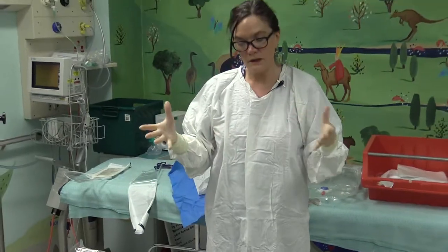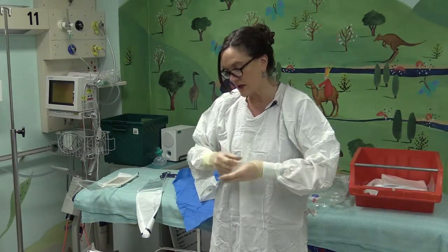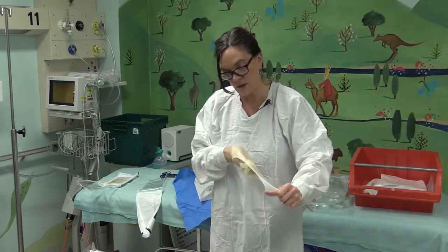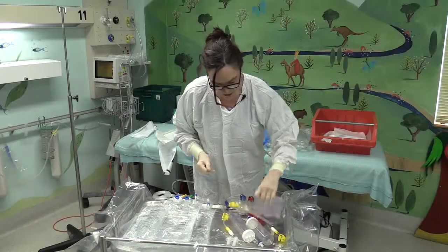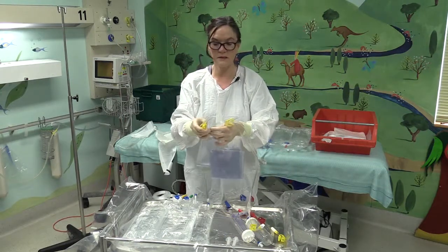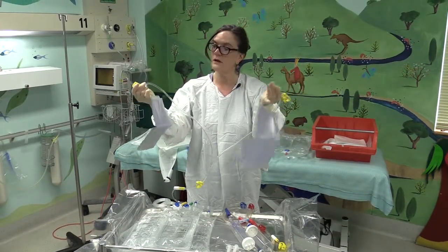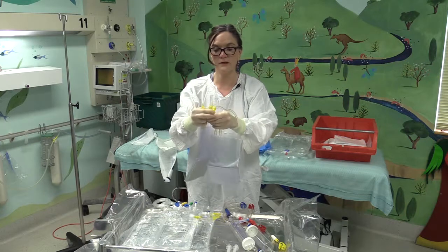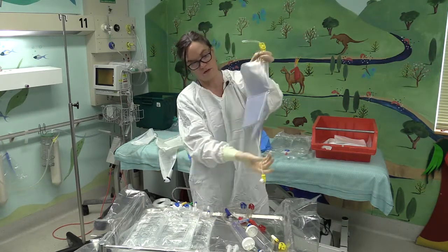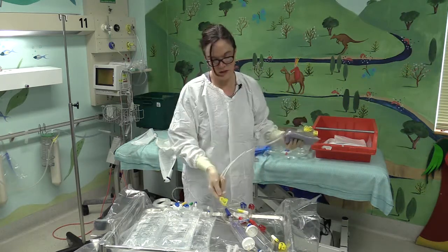I'm now going to prepare my set, and I am going to change my gloves, just in case I've touched anything or contaminated them. Okay, I'm just going to organise my set. So I have a drain bag which has got 2 large drain bags on. So clamping it off, clamp each end off so that I'm not going to lose effluent onto the floor, and then that will go to the dialysis set.